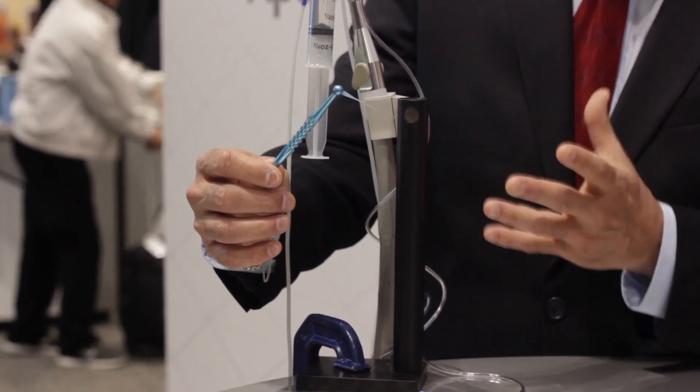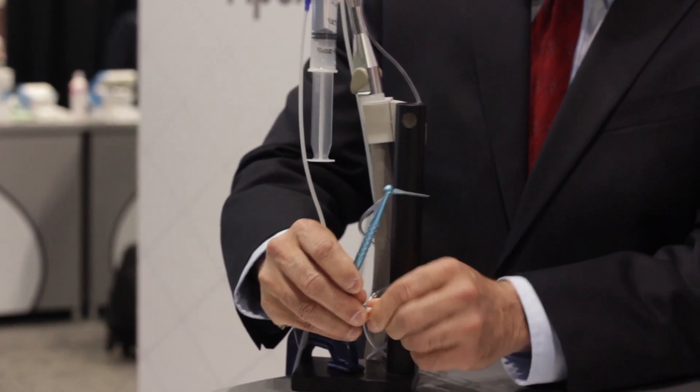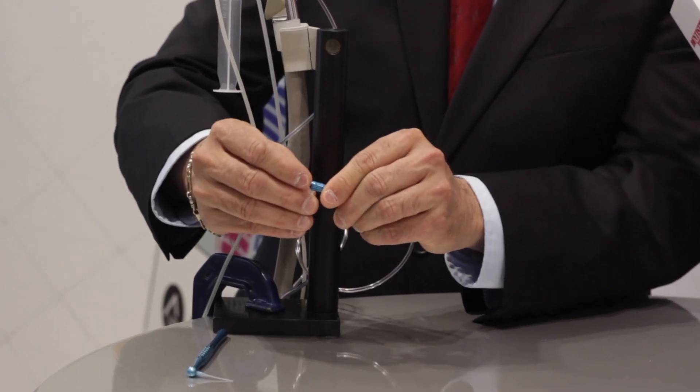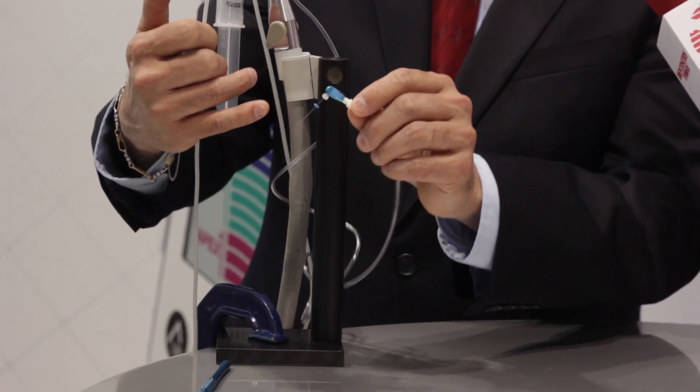The second major component is the macro delivery tip — that's the blue tip at the end of this handpiece. Since it's macro, it gets the big debris out of the canal. This is also connected to the office high-vac and simply takes the bigger components left over from the cleaning and shaping process into the office high-vac. The third major component is the Endovac micro cannula, connected through the handpiece. Believe it or not, there are 12 micro holes at the bottom of this. The dentist places it at the very end of the root canal, and it takes irrigant from the chamber, brings it down the root canal system into the 12 holes, and up again into the office high-vac.